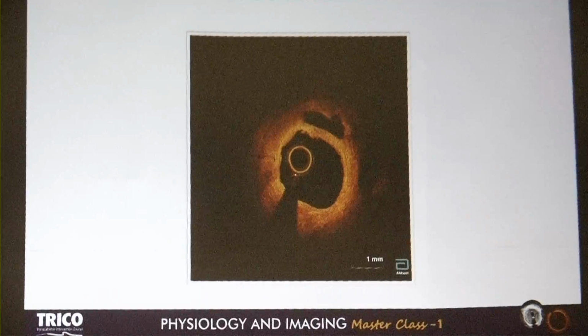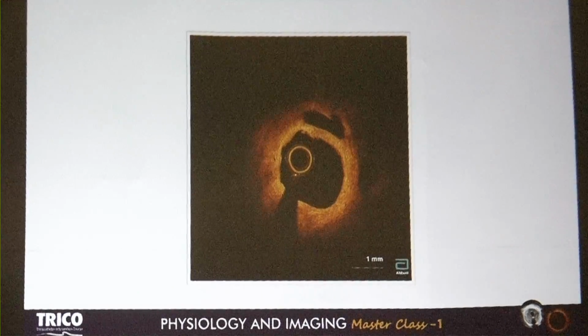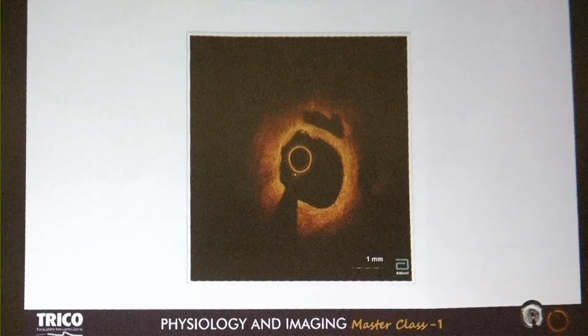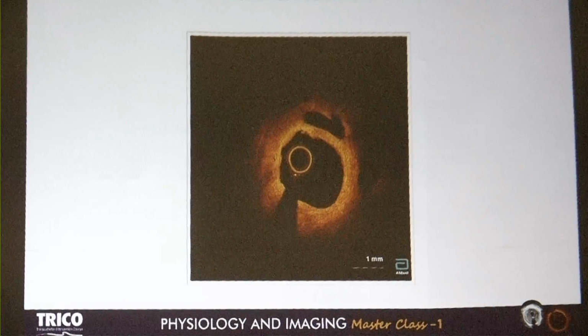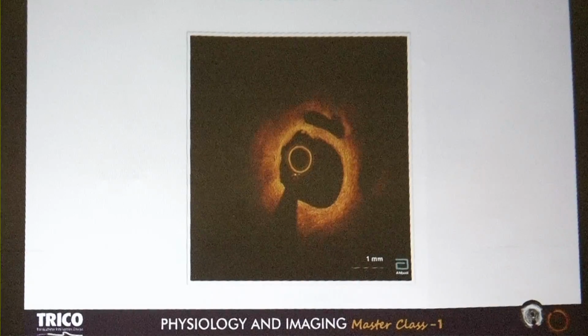But if recanalized, I fail to understand why I could not negotiate my wire, and even with balloon, I had to go with Pilot 50 after some struggle. Yeah, short axis, but also longitudinally like a honeycomb condition, right? So it might be very difficult.